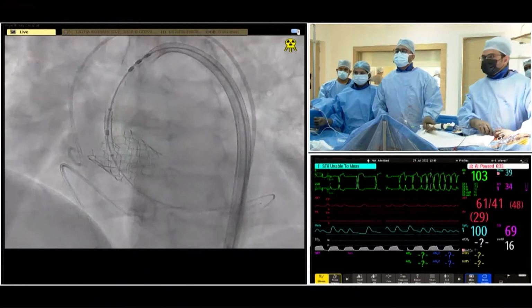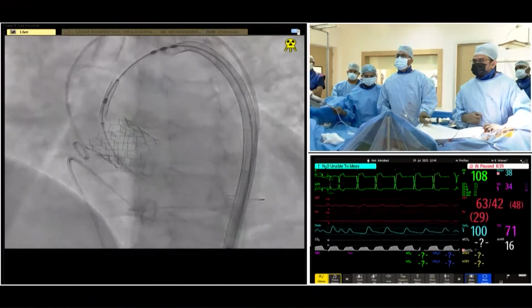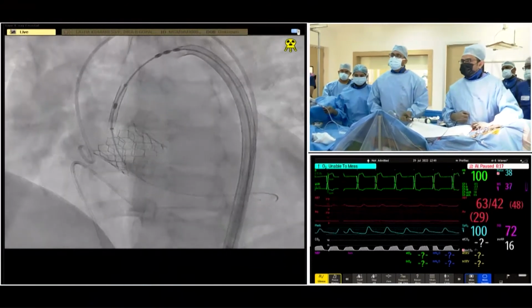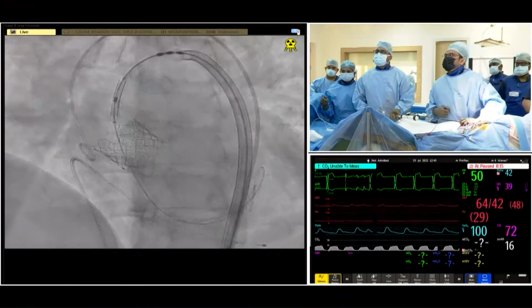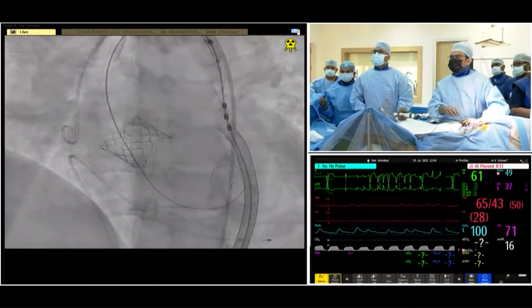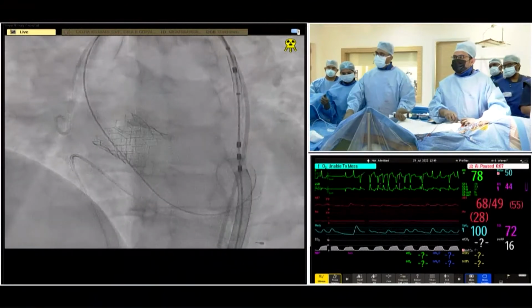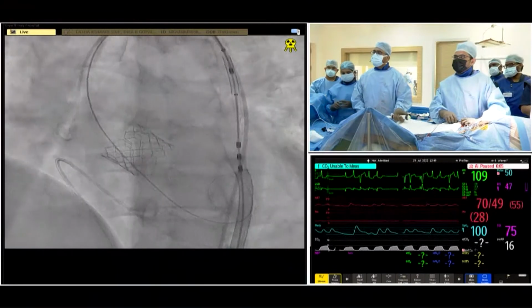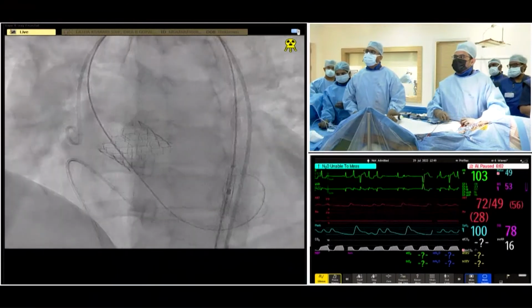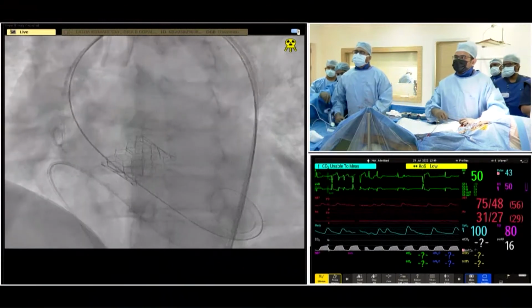Pressure recovery is a little slow, you know. Yeah, it's slow. I can give some pressures. Maybe give some AP. Yeah, I would normally just inject AP through the balloon sheath. No, the anesthetist is just doing that, so we've got things under control. I'm happy. So MAP is 56, so we can take our time. She's fine.